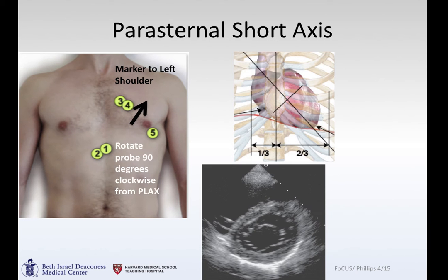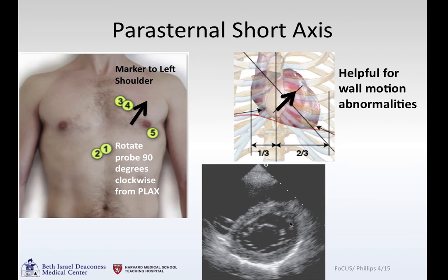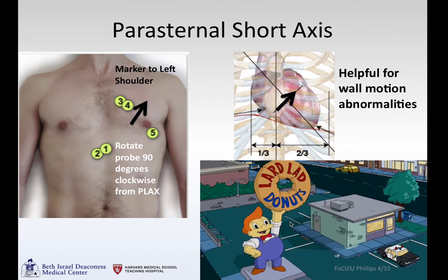Rotating the probe from the parasternal long axis 90 degrees clockwise — so instead of the marker pointing off to the right shoulder, the marker is now off to the left — you're along the short axis of the heart, and you can get a view of the heart as a donut. This is helpful with wall motion abnormalities; I like to call it the donut view.